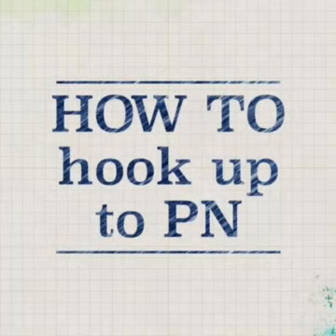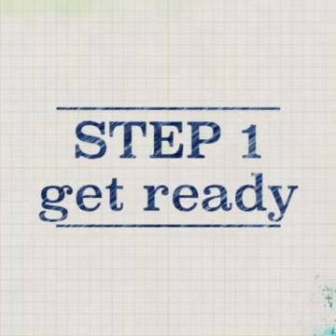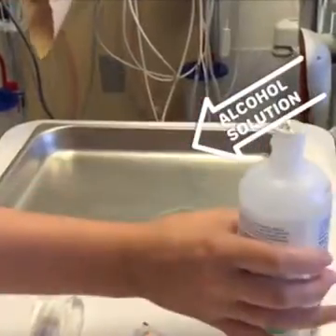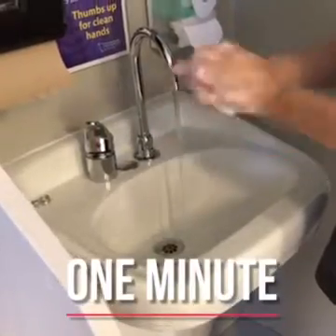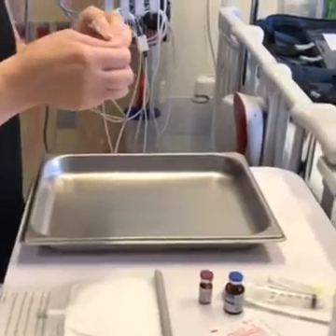How to hook up PN. Step 1: get yourself and your supplies ready. Clean your work area with alcohol solution, dry with paper towels, and wash your hands for one minute.